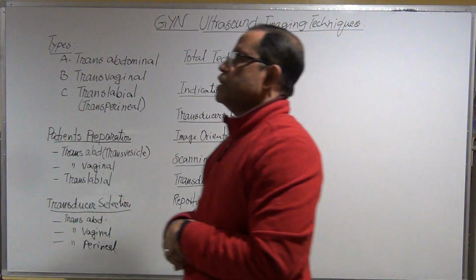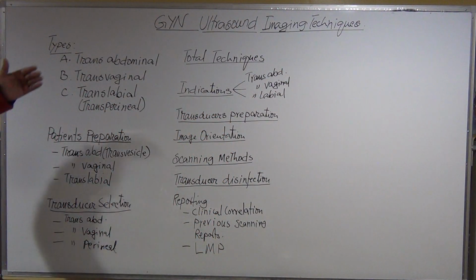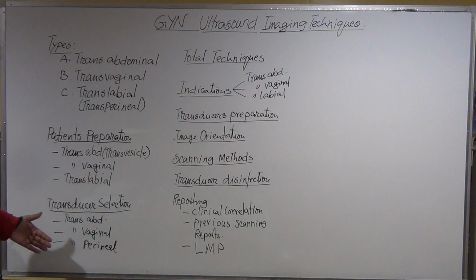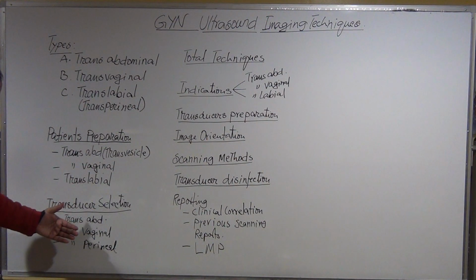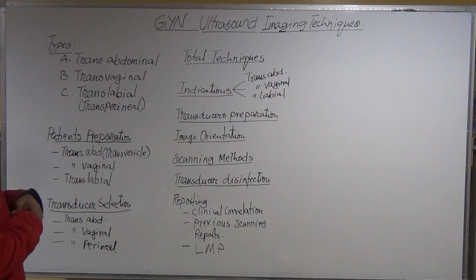Okay, so it is very important to understand how careful you have to be to select the appropriate transducer with a frequency for individual types of GYN protocols.